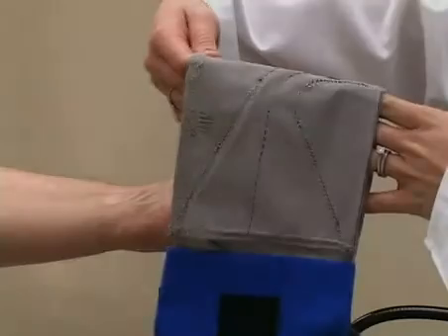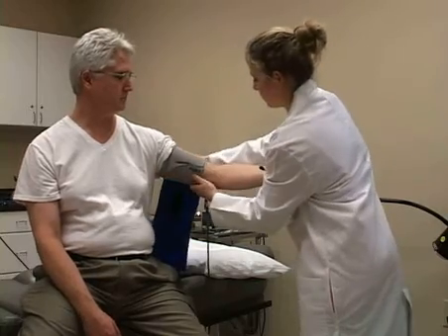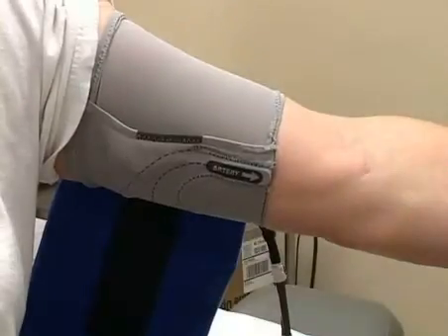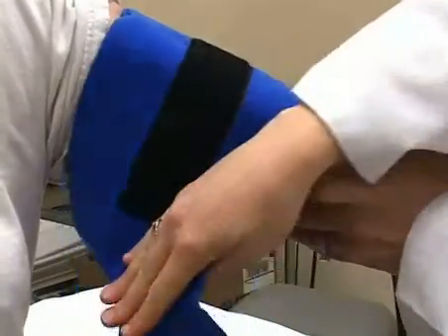After properly placing the patient's hand into the elastic sleeve, slide the cuff up the patient's arm, ensuring the artery arrow points down the arm with the microphone over the brachial artery. It should be on the medial part of the arm, not on top of the bicep.